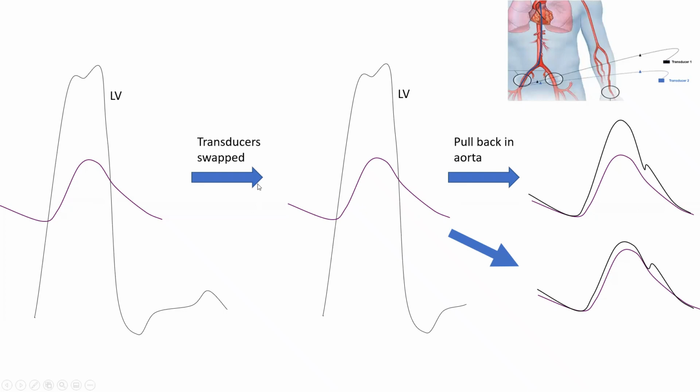I need to redo my recording using another strategy. So if what you did was putting a 6 French catheter in the aorta and 4 French in the LV, you need to do something different since you were damped and you couldn't correct that damping in the catheter. One thing you can do is put a 7 French long catheter in the aorta with a 4 French in the LV. Or if it was the LV pressure that was damped, then you can put 7 French in the aorta and 5 French in the LV. So you create more space, larger catheter, more space in the catheter.